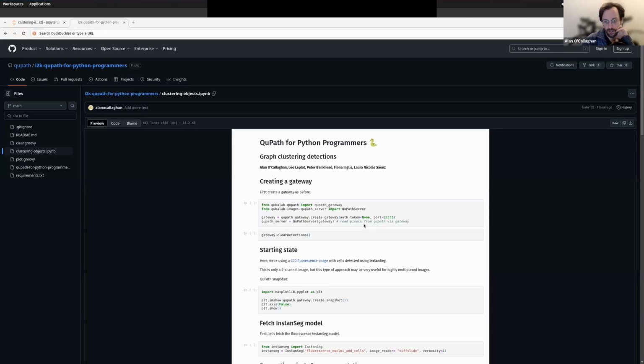Okay, so things like metadata. I believe that you can update the image metadata, adding arbitrary key values there. That would be one place to put it, I think.